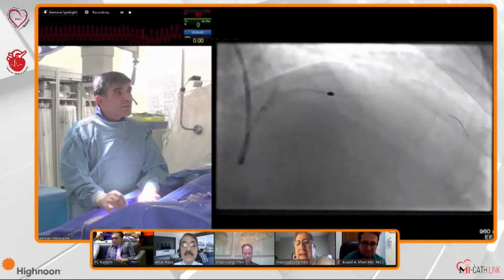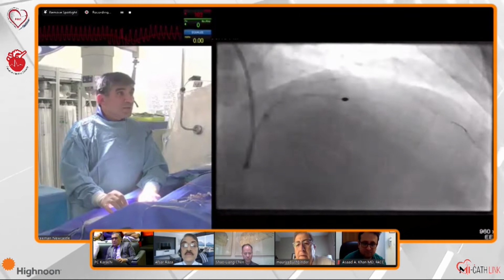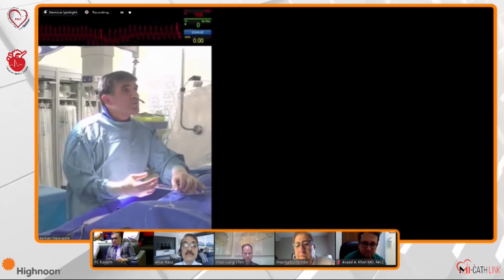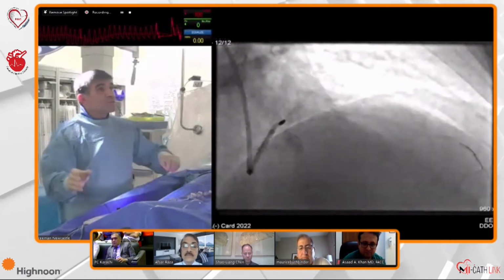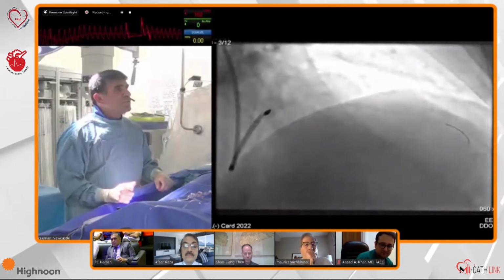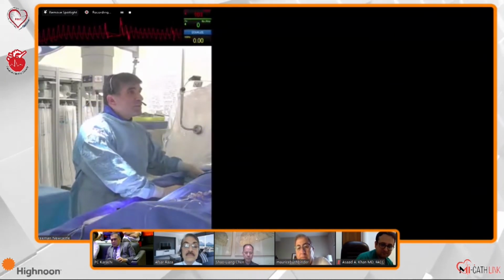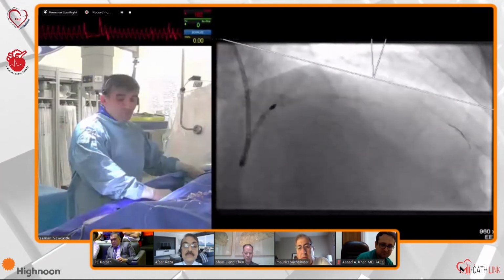And it looks like the 2.0 is moving well. Yeah, now I've gone through the first hurdle in the left main. There you go, just a little test there. Store that. Now I think 2.0 for the distal part is a little bit too big. Yes. I think there's no point in trying to force it that way. I think I'm going to leave that part alone. It's the left main that's my main concern, and I think I'm going to just leave it there.